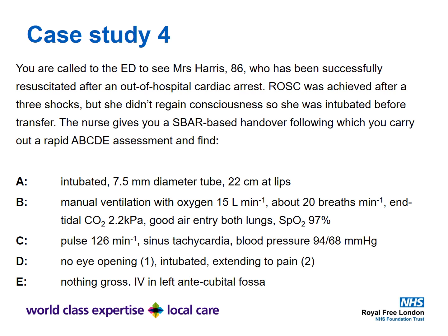Case number 4 of 5. So you're called to the emergency room to see Mrs. Harris, who is 86, who has had an out-of-hospital cardiac arrest. She's been intubated, she has a return of spontaneous circulation, she has a handover which is as follows.